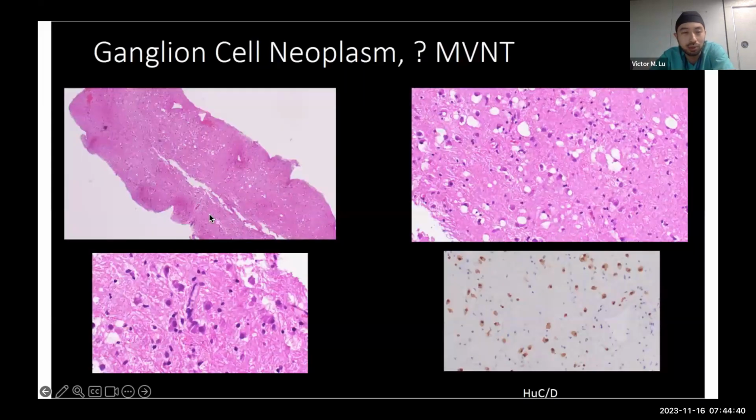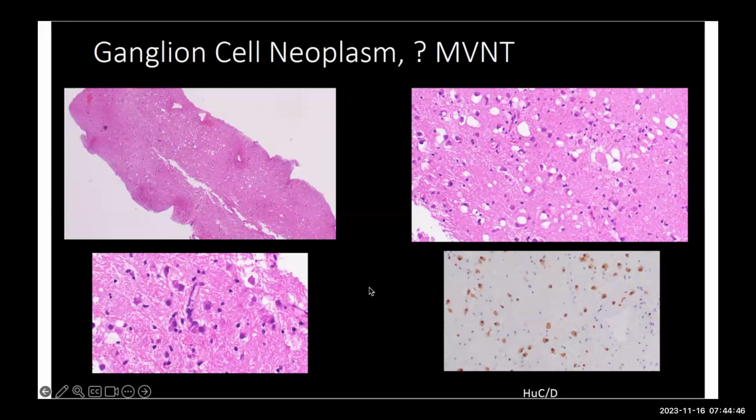So, Dr. Gultekin, we have two pathology slides for this case. Yes, thank you. So this was a really interesting case. I'm showing you one of the needle biopsies on the left top. It's a small biopsy, and we had several of those which all showed the same thing. So they were in the lesion. I have to think about cerebellar roof nuclei being biopsied also because of the neuronal nature of this lesion, but it was lesional. It was not normal structures.